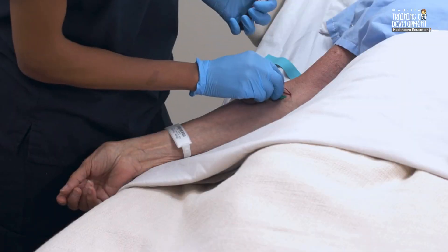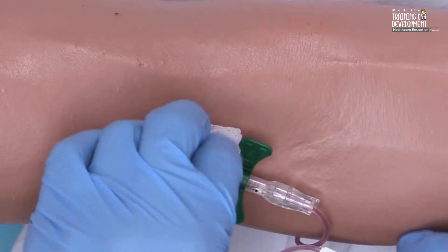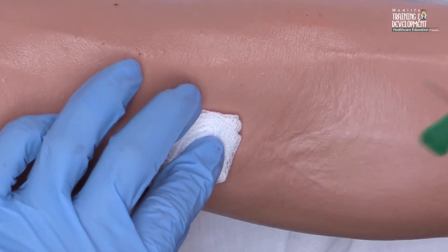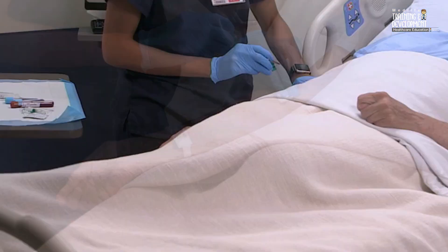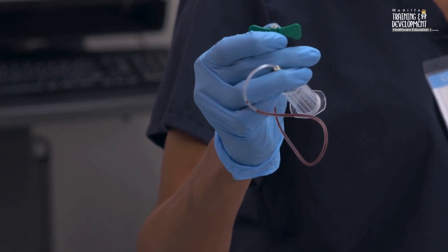After you've drawn the samples, place a gauze pad over the puncture site and slowly and gently remove the needle from the vein. When you're using an evacuated tube, remove it from the needle holder to release the vacuum before withdrawing the needle from the vein. Activate the needle protector safety device if necessary.